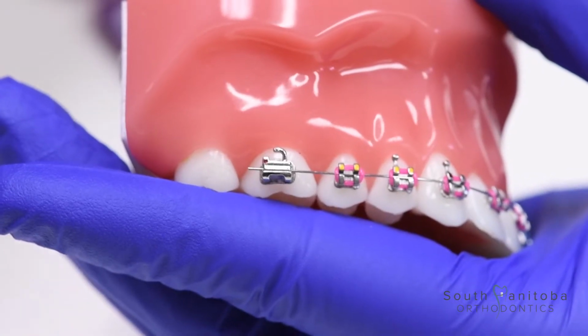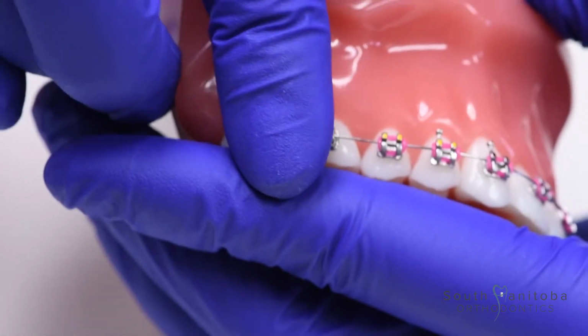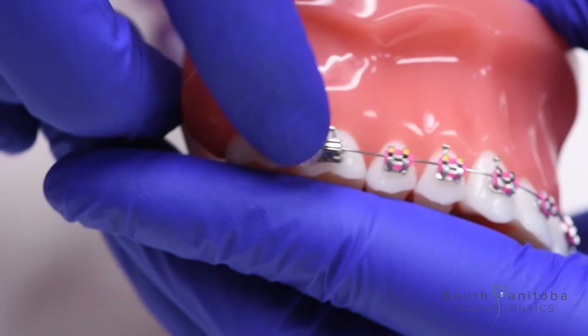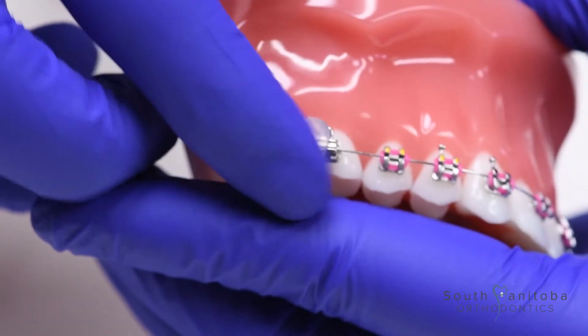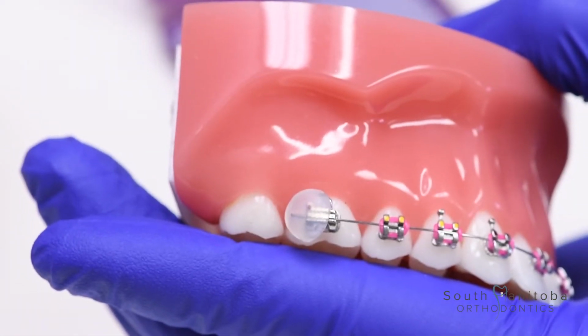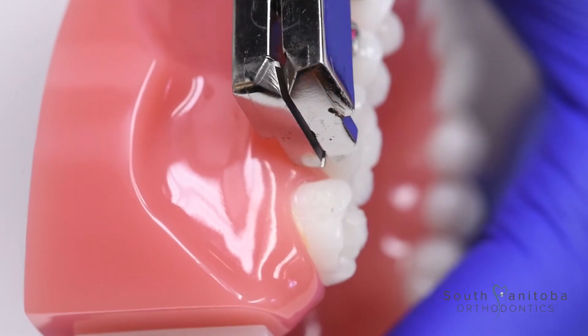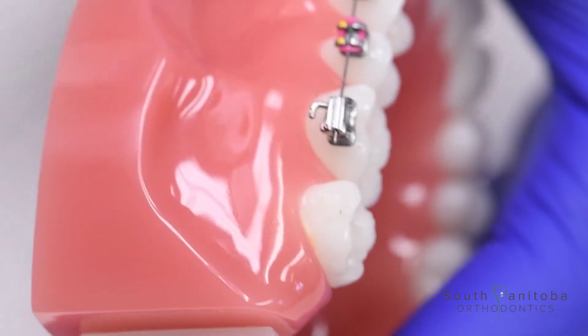Sometimes the wires can become a little long as the teeth move and align, especially in the beginning of treatment. Try to use the orthodontic wax first. As we explained before, this usually helps a lot. If even with the wax in place the discomfort persists, you can give us a call to book a quick appointment and we will clip that pokey wire for you.